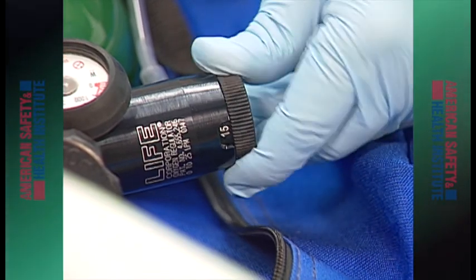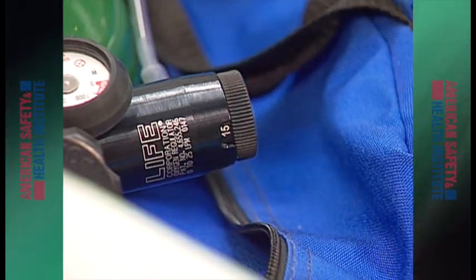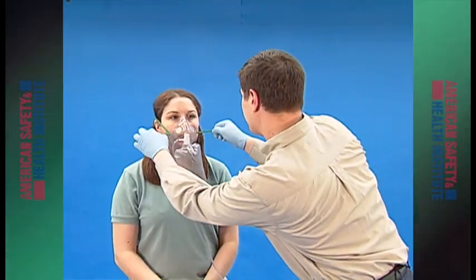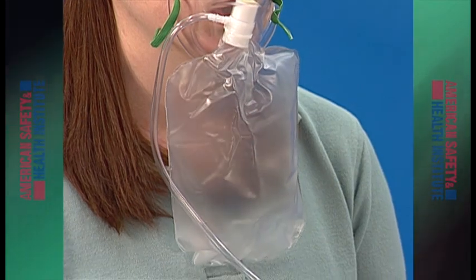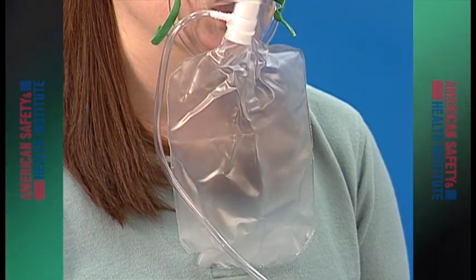Use the highest flow rate available, between 10 to 15 liters per minute. To ensure high oxygen concentrations, make sure the mask seals well around the patient's face and that the reservoir bag never deflates below 1/3 full.